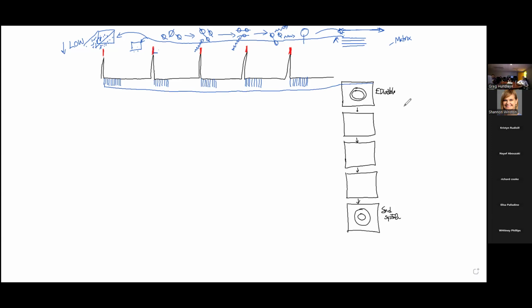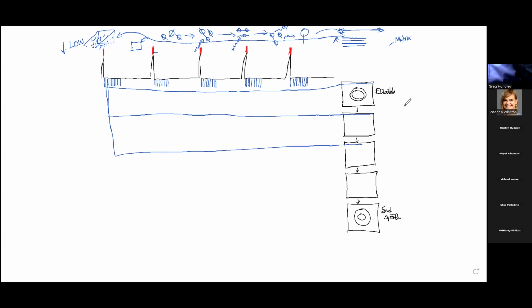And then at the next interval in time, we're going to come over here and populate another line of the next frame, right? Remember our matrix?